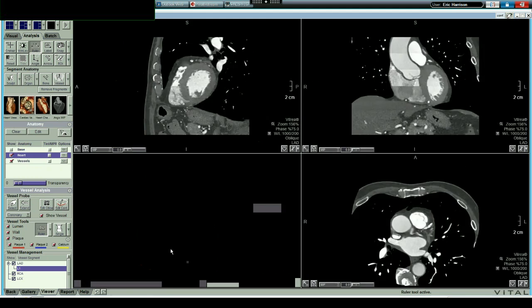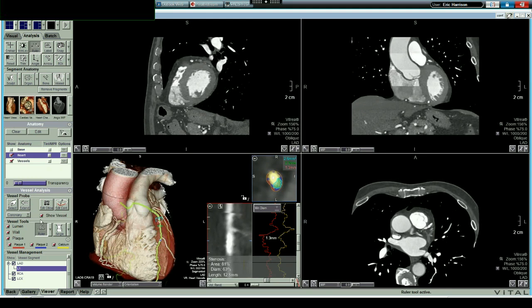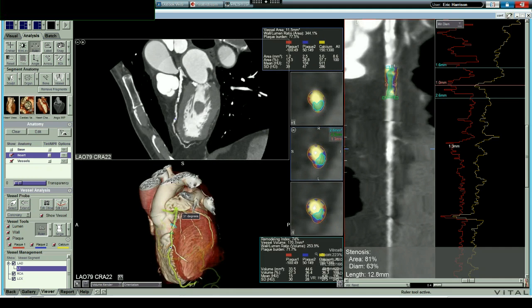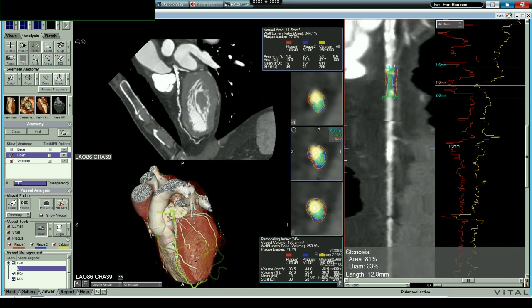And so these numbers and all this information steer us toward understanding how risky this plaque is, and what kind of problems we need to worry about here. And so that was the information we had, and we said this is a very high-risk plaque. It's going to thrombose, but we're going to put him on some medications and try to prevent that. And so that was our goal, and we found the origin of his chest pain. So let's go back to our slide deck.